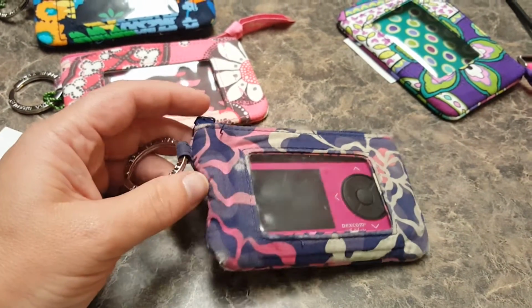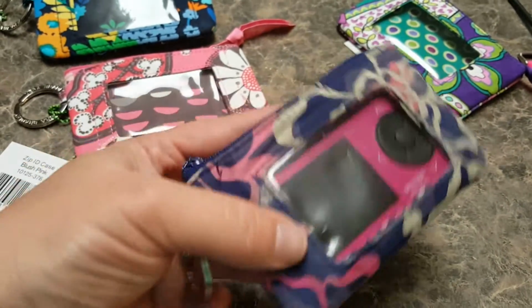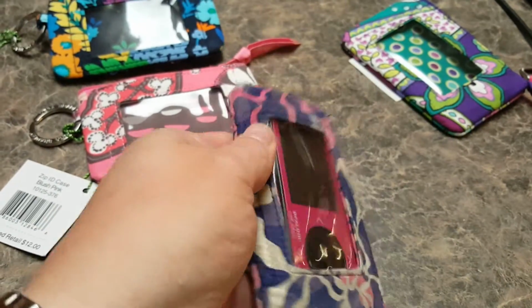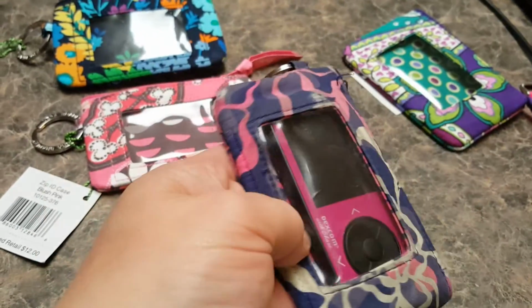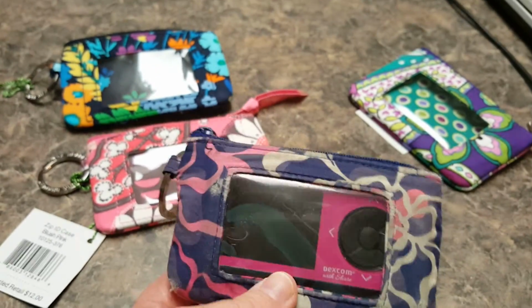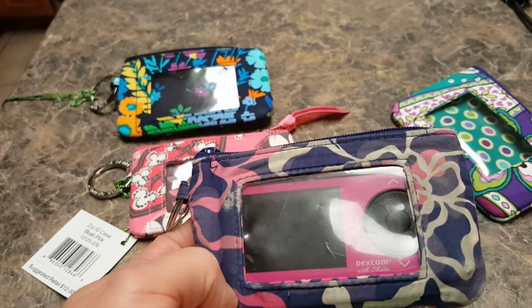So in this older pouch, I've taken the entire seam out on the front, and it has a lot of movement inside the pouch. It can move and flop around. It's really not a big deal. You can still see it, but I like it to be more secure, like we get when we just take out one seam.